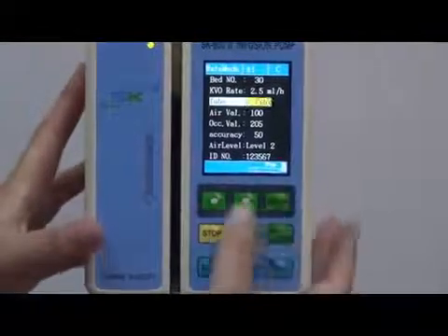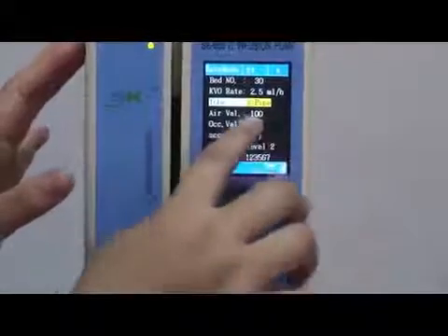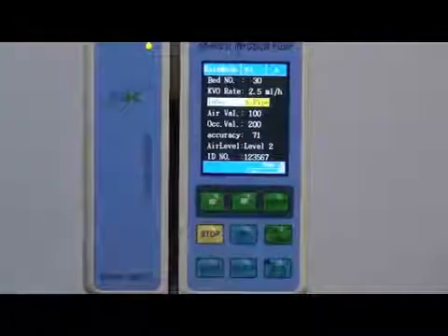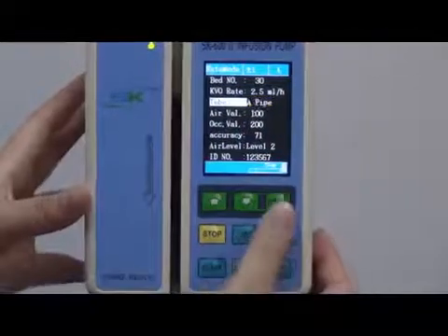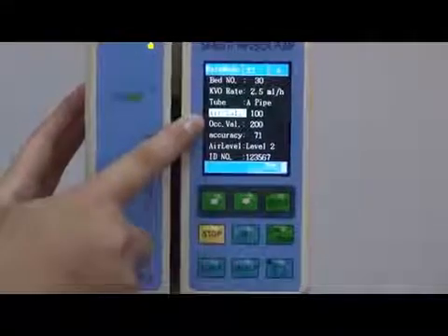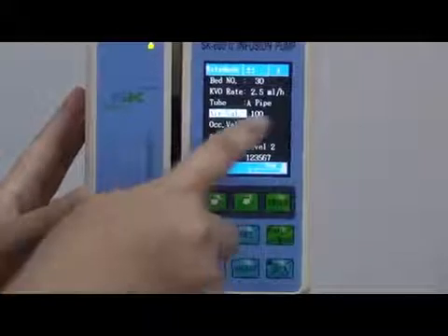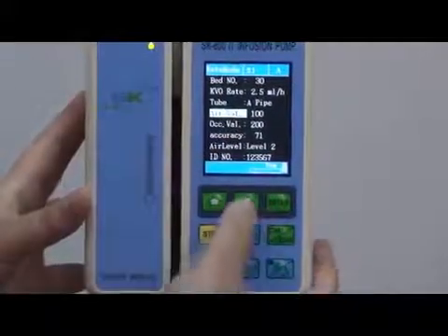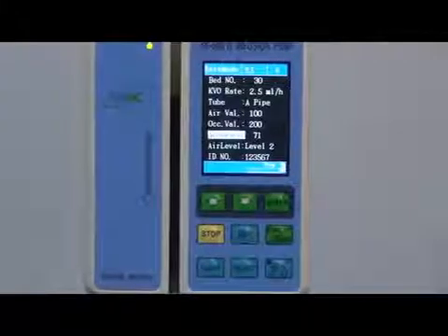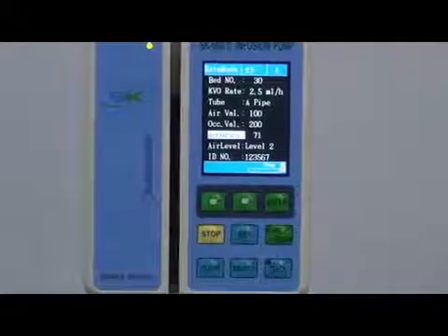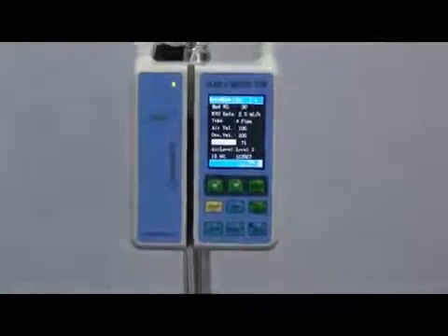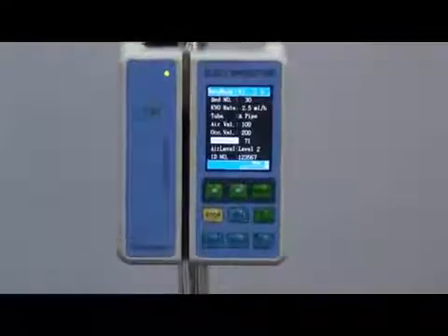Let's change it back to pipe A, since the hospital uses pipe A the most and it is the default. Next is the air bubble value — we don't suggest you change it, there is no need to change it. And the occlusion value — the same, no need to change. Next comes the accuracy value.